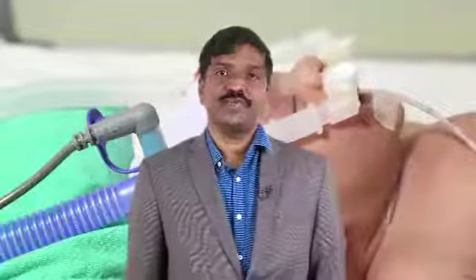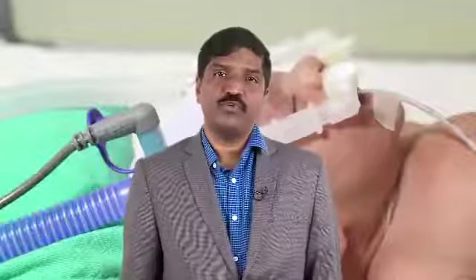Now, the pressure generating water chamber should always be placed below the level of the newborn. If the water level increases, excess water will drain into the side chamber. However, if water evaporates, the water level could fall, resulting in reduced depth of immersion and reduced pressure generation in the CPAP circuit.